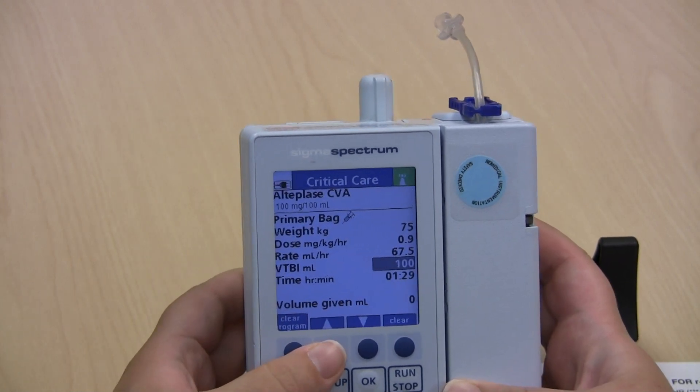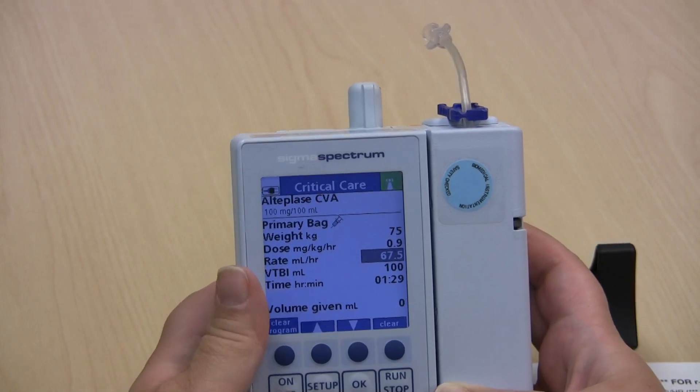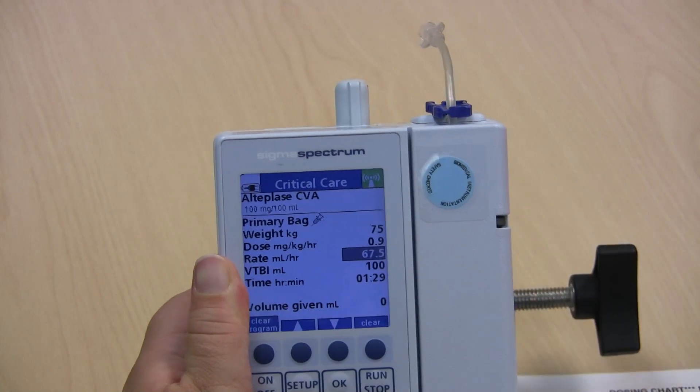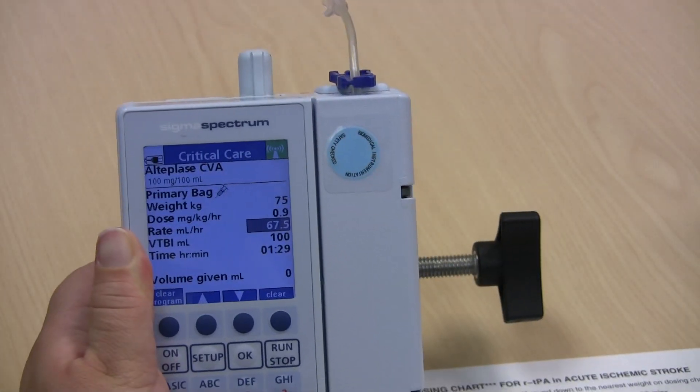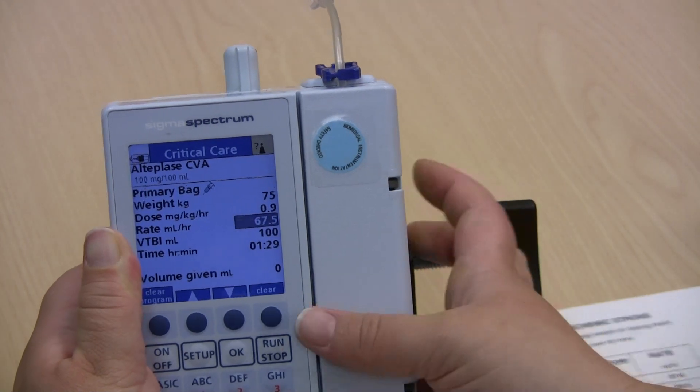At this time, scroll up to change the rate — do not enter the volume to be infused yet. The rate you get off of your dosing chart: I am going to set my rate at 60.8 milliliters per hour.